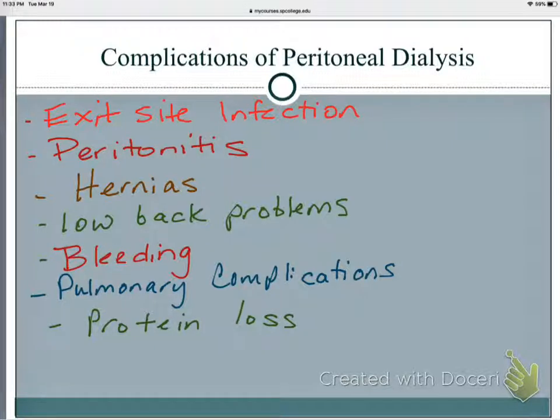The patient may or may not have a fever. Pardon? Clear is normal, yes. But if you have a cloudy effluent, that is not normal. That needs to be reported to the provider.